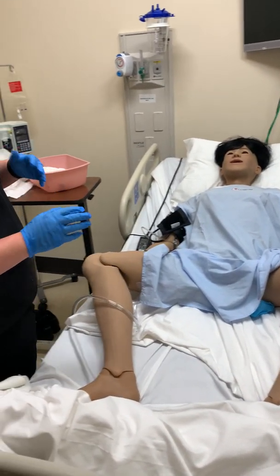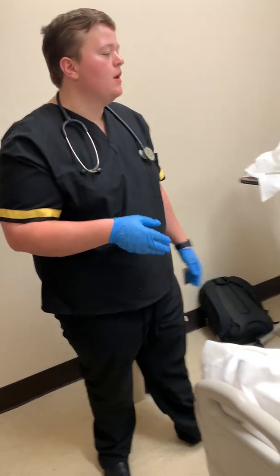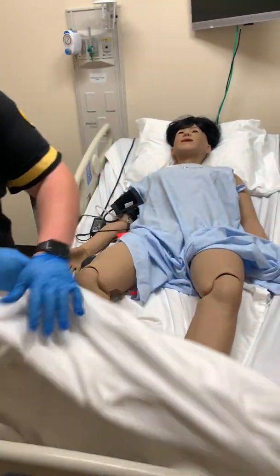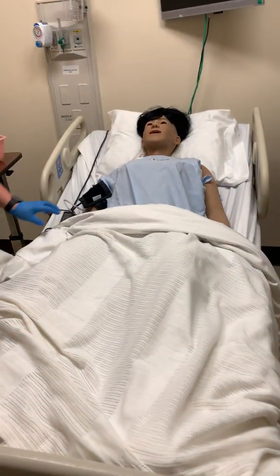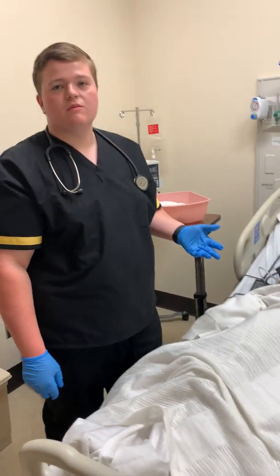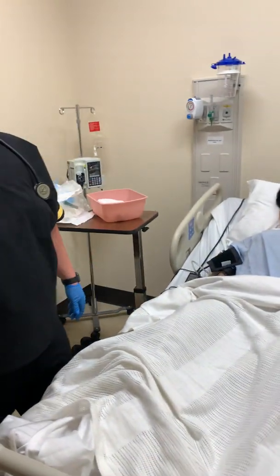And so we've left, and now it's time for us to discontinue the catheter. Our patient will have, of course, been here for several days. Not several days, but several hours. Ms. Smith would have been comfortable. We would have made sure of that before we had left. Now we come back, and the doctors ordered us to discontinue the catheter. We come in like we did earlier.